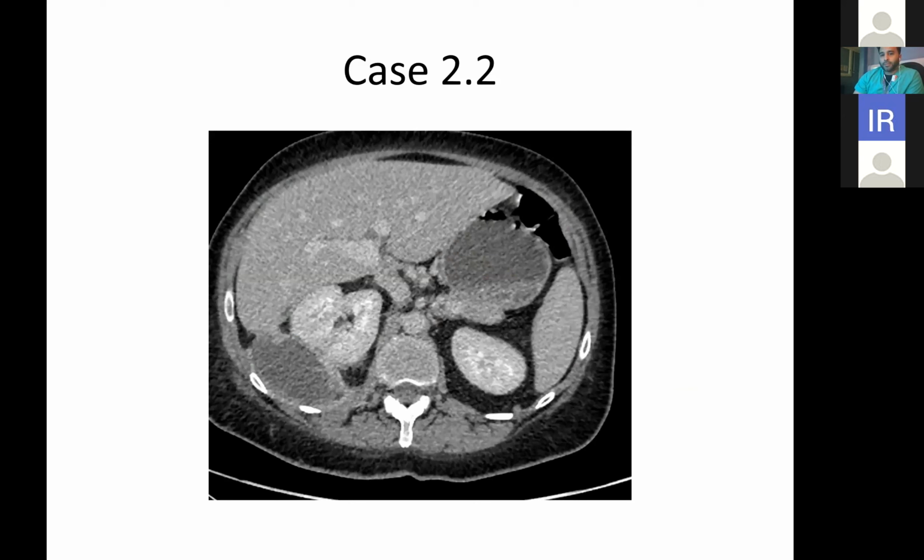So this is a similar case where a patient came in with loin pain, infective features. And as you can see here, this is obviously a collection next to the right kidney. Now, sometimes with regards to retroperitoneal collections, you may have, for example, a patient who may have a collection on this side, for example. And they may have really bad acute pancreatitis that has developed a collection near the pancreas, and your window of opportunity with regards to trying to get into a collection on this side can be a bit challenging, especially if you've got to kind of go between the spleen and the stomach.